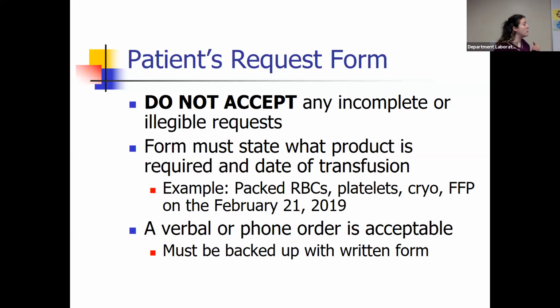So typically we want a written order. We like a paper trail in blood bank. However, if you have electronic medical records, it's all electronic now too. But a verbal and phone order is acceptable, but must be followed up with an official order, whether it be a paper request or in the patient's chart. All right. A verbal order would be like if your patient's in the OR and they're saying, I need 2 units of packed red cells on this patient, like right now. I don't have time to go in the computer and log it in. I need it right now. Okay.